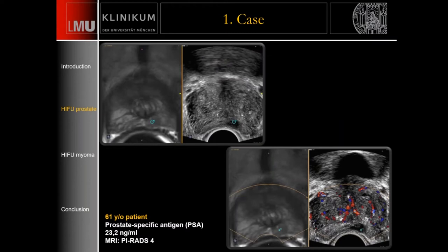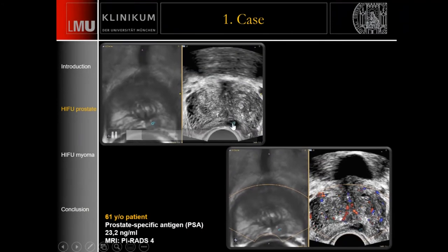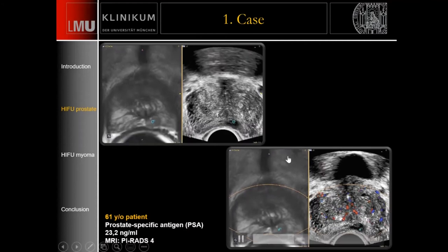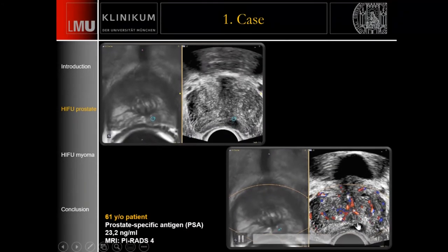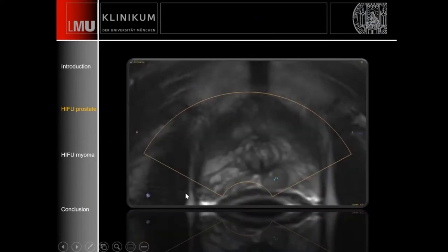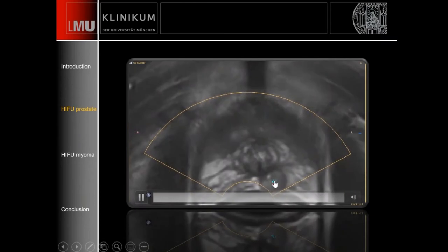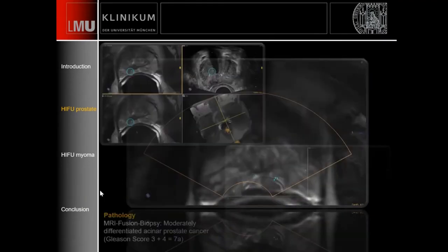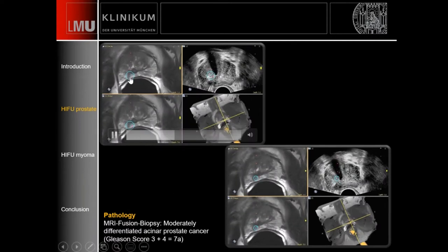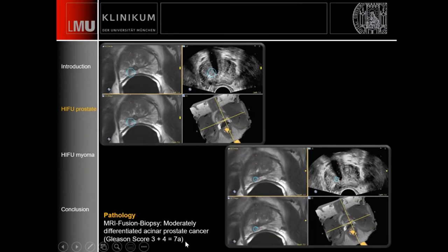This is a 61-year-old patient with a PSA of more than 20. The MRI described a PI-RADS 4 lesion. After registration, you see the lesion on MRI and the same marker shown on the ultrasound image. Looking carefully at vascularization, this lesion showed no major vascularization compared to the rest of the prostate. The registration quality is good when switching between ultrasound and MRI. We then performed the biopsy — the needle hit the lesion, and this was confirmed as a Gleason 7a score.